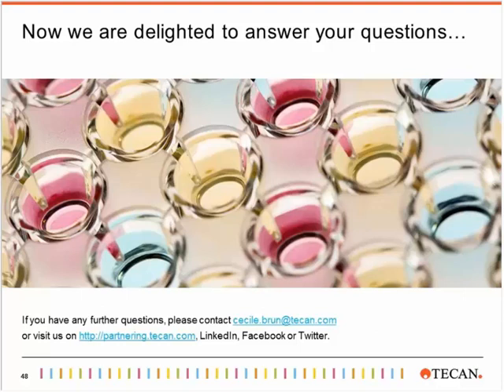In my previous embodiment in molecular diagnostics, I worked with oncology samples, and they were terrible. The pathologists would always want to fix them in formalin and put them into paraffin and all manner of insults before you got your hands on them. But one of the things I've enjoyed about working in this field is that the samples tend to be pristine. Once you've taken a blood sample and spun it down, it really is pretty stable. So the quality of the DNA is actually very consistent.